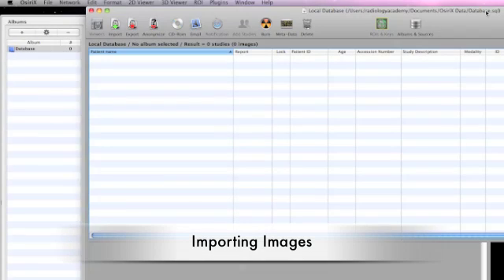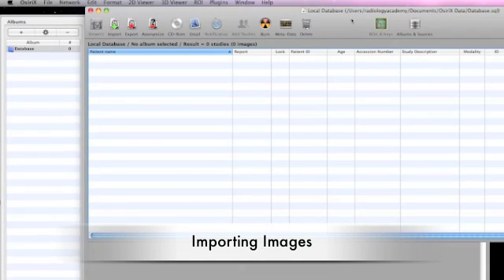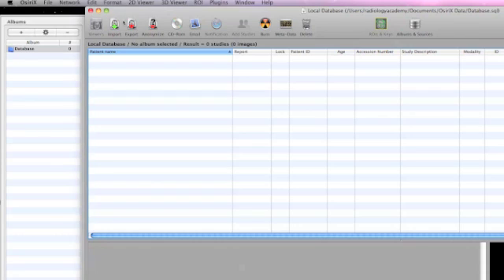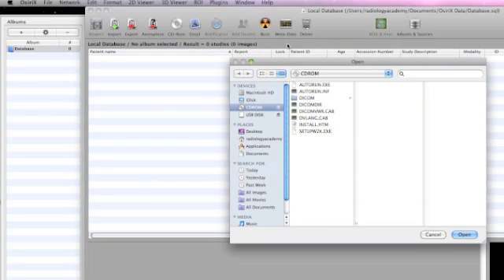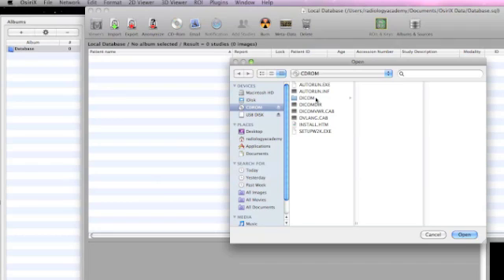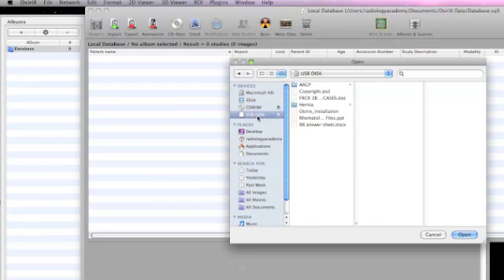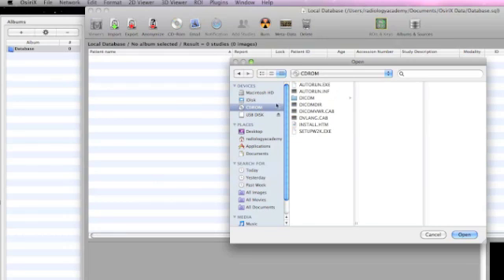Right, importing images. The way the system is now set up, when you put a CD into the CD bay, the CD will automatically load up to the database. But what happens if we are importing images from other sources, such as a USB or another data source? If we go to import, in this particular case we are identifying a CD-ROM, but we could equally identify a USB.